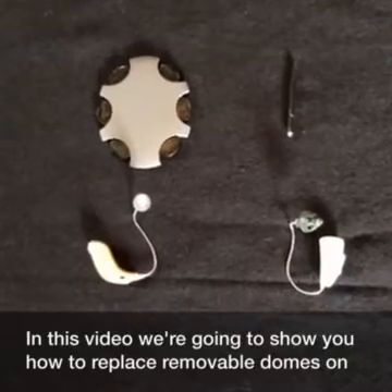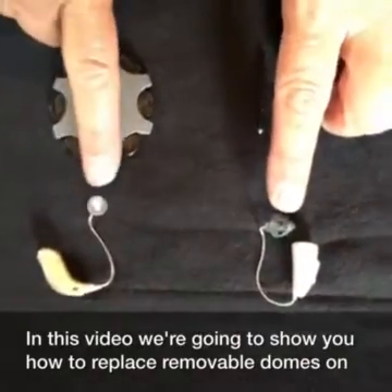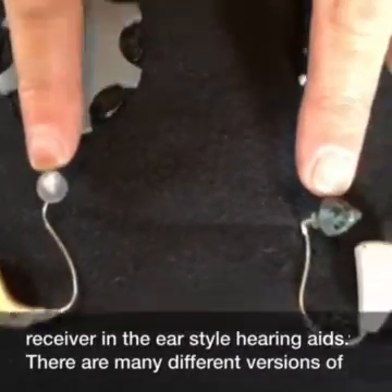In this video, we're going to show you how to replace removable domes on receiver in the ear style hearing aids.